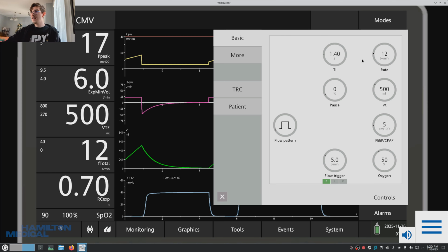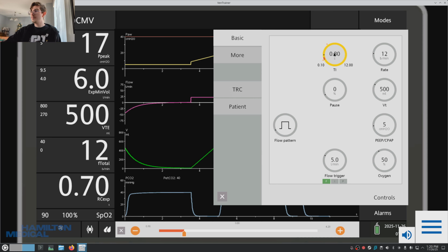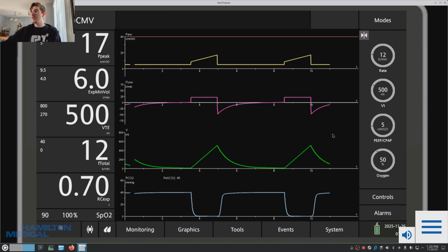Now, I'm not going to say your patient needs any specific set flow. You should set flow to be above their inspiratory demand, right? And maybe their inspiratory demand is only 15. Maybe a flow of 20 is fine. But that's up to you to determine.